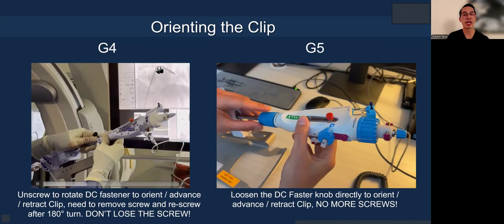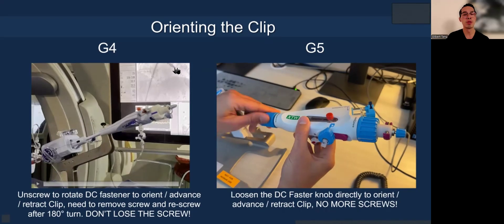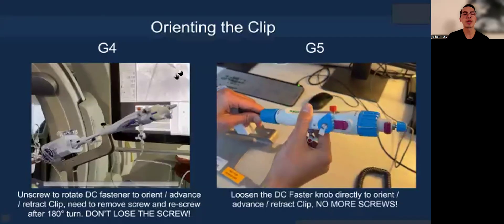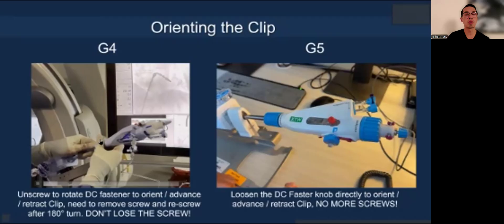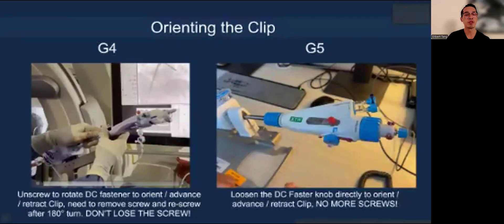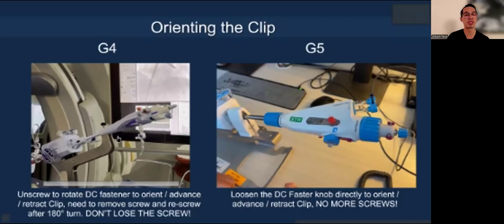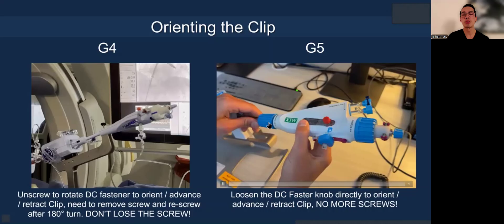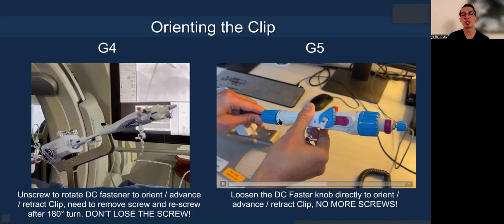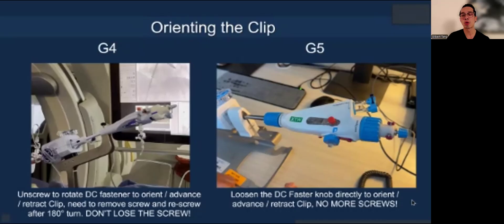Once you exit and steer down to the mitral annulus, you want to do what I call 'jiggle-jiggle' to orient the clip in the RAO caudal view so you can see how it lines up without parallax versus the mitral annulus. In G4, you had to loosen the screw, and if you needed to go 180 degrees, you had to bring the screw all the way to the opposite side. A couple of times I lost a screw on the floor and had to find a replacement. But now the DC fastener is integrated — you just turn clockwise to unfasten, do your jiggle-jiggle to orient the clip, then turn counterclockwise to fasten again. Much more ergonomic.